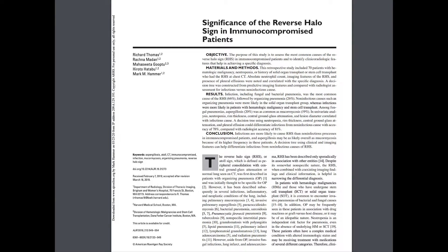We're going to talk about the reverse halo sign, which is sometimes also known as the atoll sign. If you remember the coral reefs that surround an area of ocean, they form a semicircle — that's the atoll. It's now mostly known as the reverse halo sign, originally described in patients with organizing pneumonia, but there is a differential diagnosis. Let's jump in with our differential diagnosis.